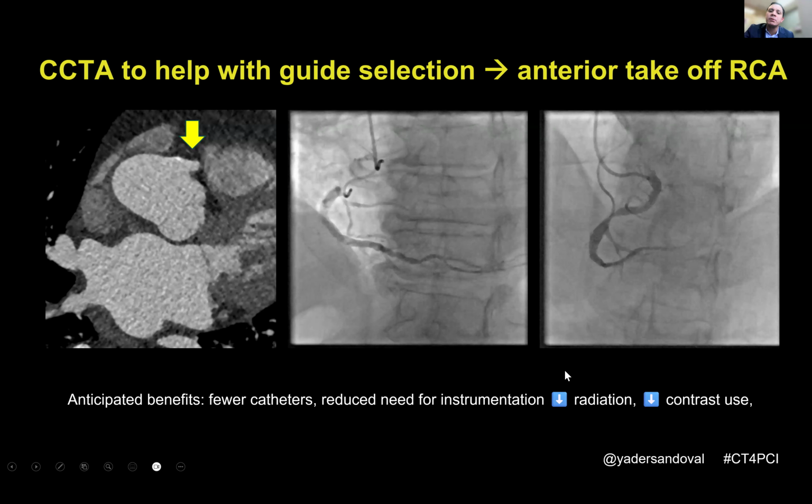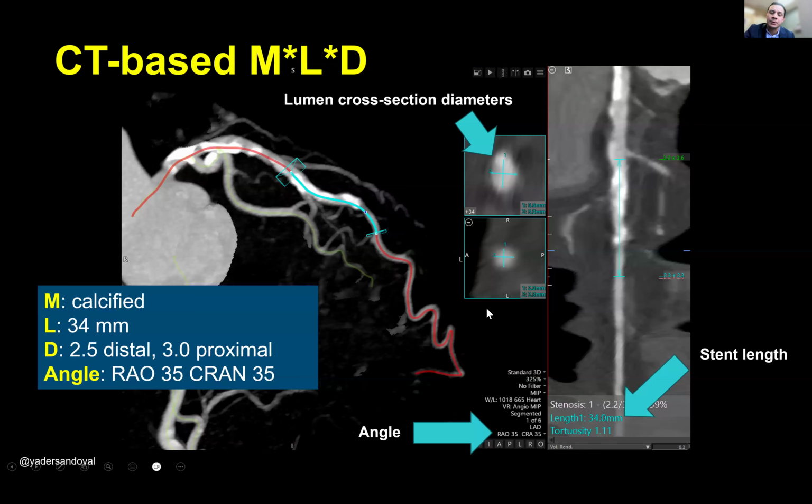And this is what we're learning more and more. This procedure has a lot of value. Now, of course, there's a lot of software that I will show that is really pushing how we interact with this data, but I think it's important to also take a step back. And the reality is that CT-guided PCI can be enabled with a standard post-processing visualization software.